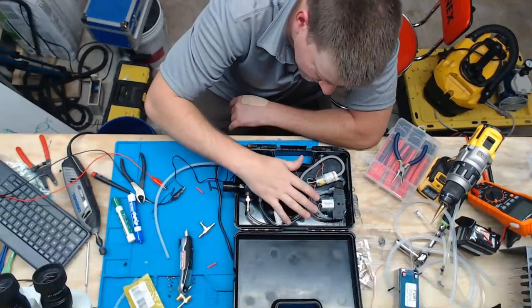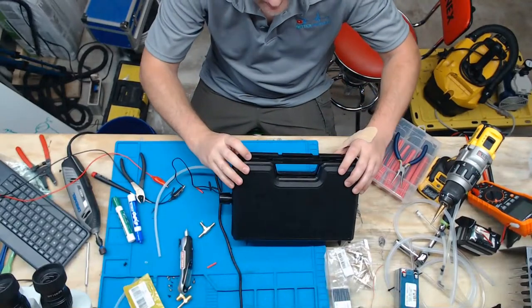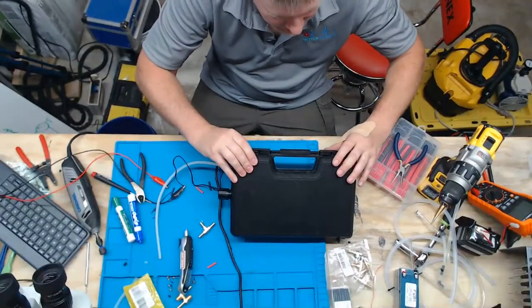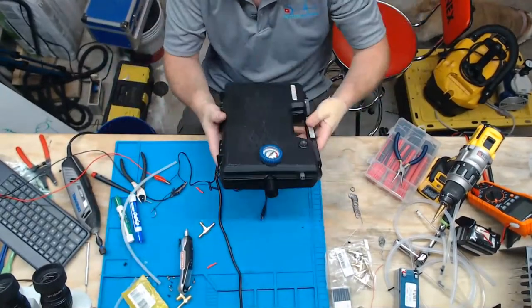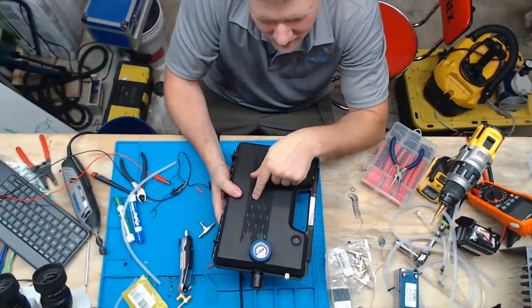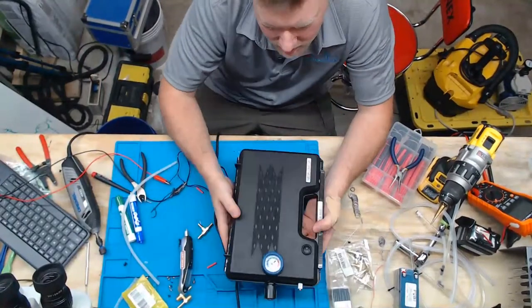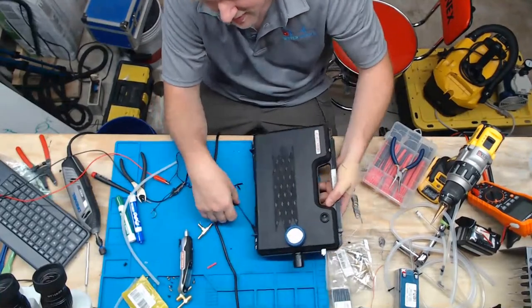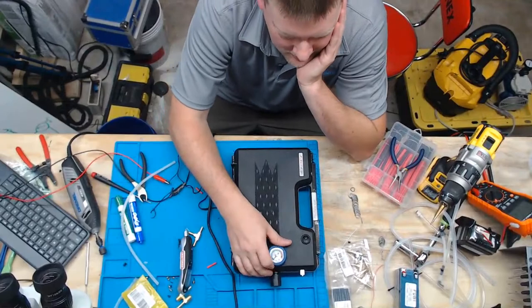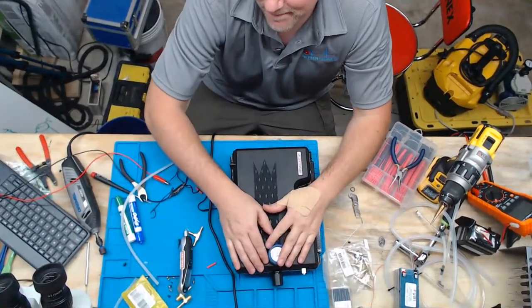And that is exactly what this guy is. It's a portable air power source. I guess that's the simplest way to put it. It's just a portable air source. And I need to find a way to put a battery inside it, make it chargeable. Maybe I'll make that the charge port. We'll figure it out. But a neat little device. I've just been thinking about it for a long time, and today I just decided I'm going to do something about it. I'm going to build it.